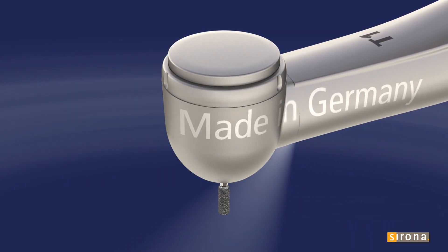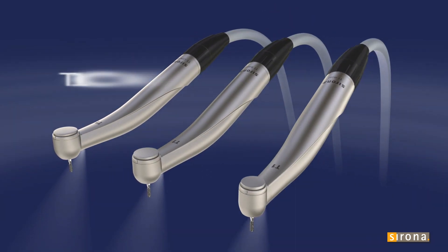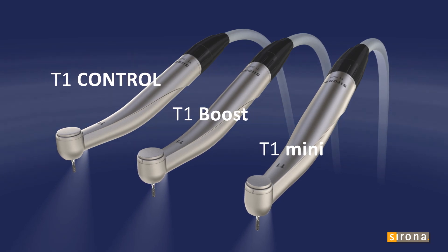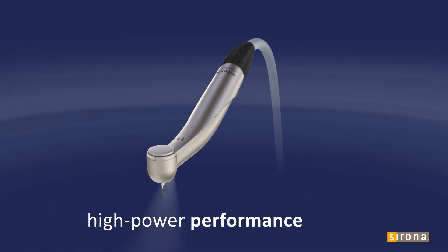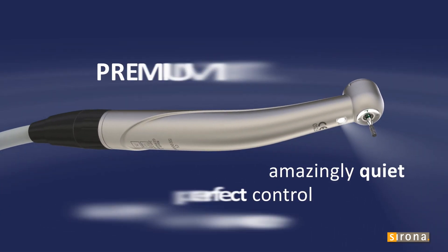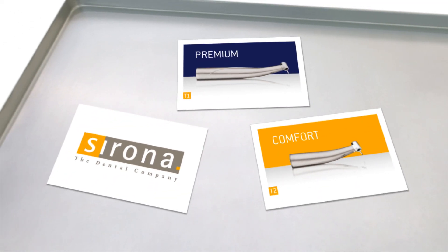Sirona stands for quality. Made in Germany. The perfect turbine for every application. Ideal visibility of the preparation site, and perfect control for your patient's well-being. High performance. Perfect control. Amazingly quiet. Sirona T1 turbines — a perfect fit in every way.